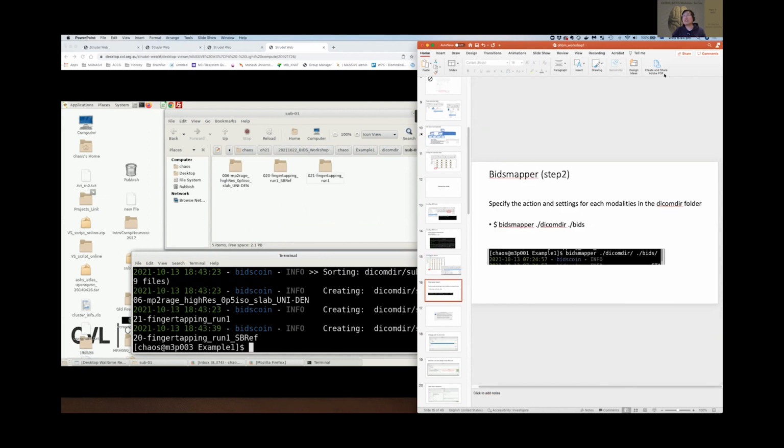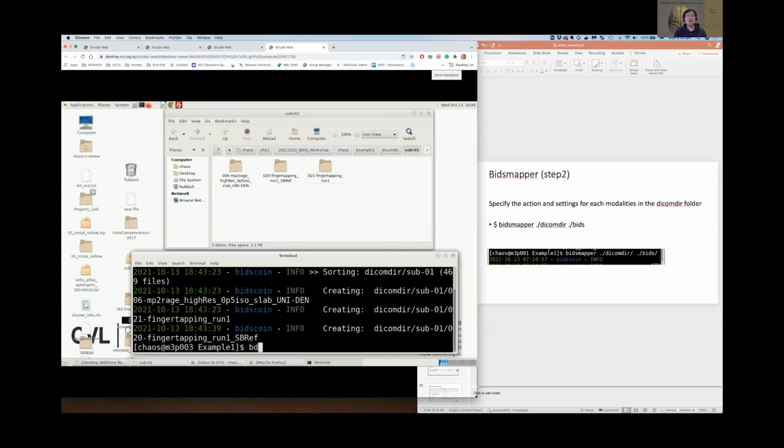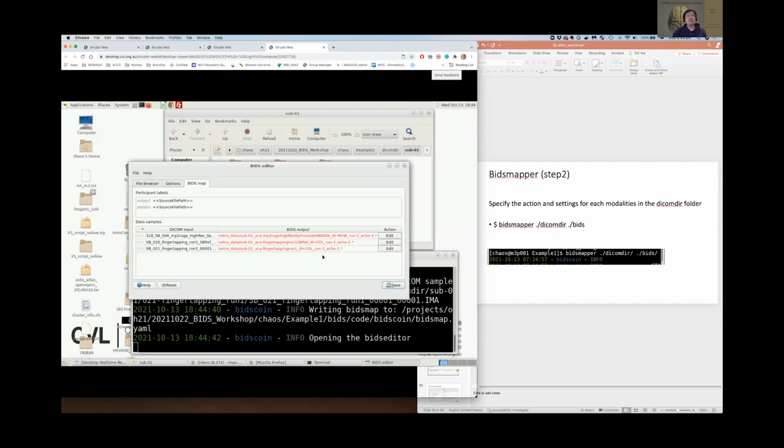The next one, step 2, is simply called the BIDS mapper. I like it pretty much because it brings a GUI, rather than us just working on the terminal or code. So this will give you a little bit of relaxation. Just type in this command, BIDS mapper, as this is the name. It's just mapping all of the DICOM to the BIDS format, and then telling it exactly the actions and the settings we need. Okay, so I press that, and it will load a little GUI here. So you have all of the information you need in the GUI.